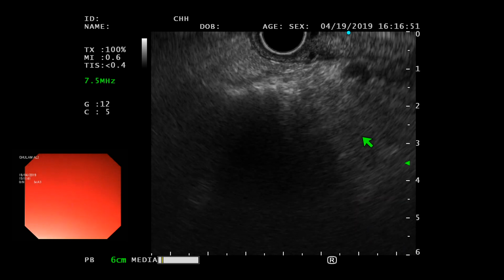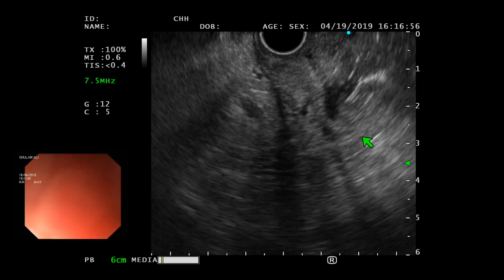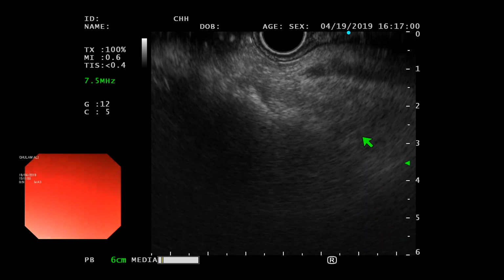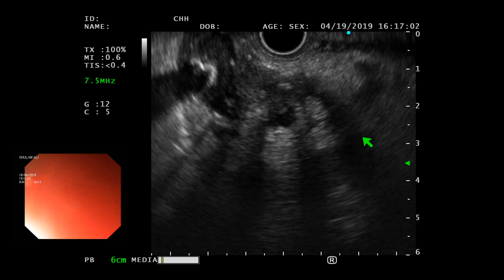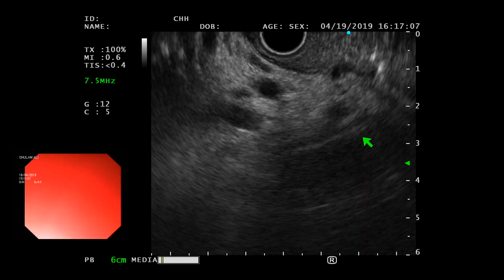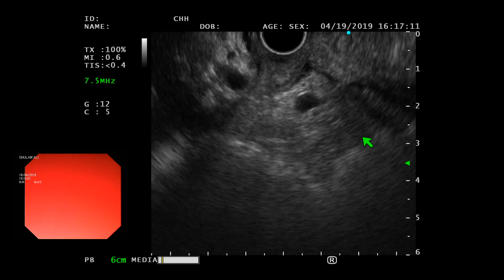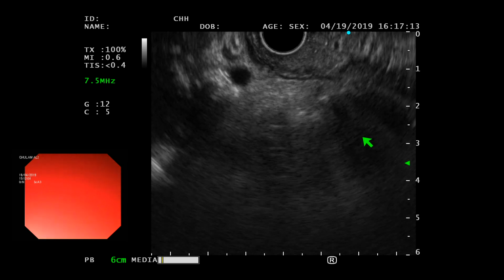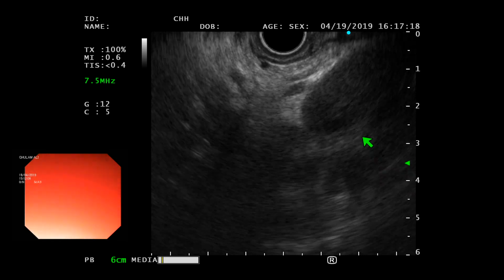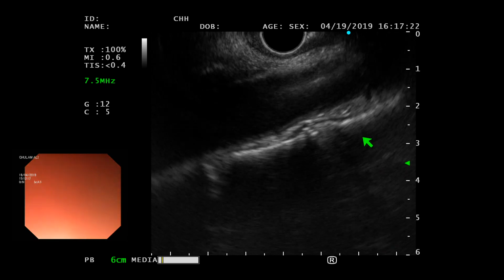Okay, this is the kidney. I have already turned behind while getting the spleen, and I don't see any spleen yet. No, I don't think it's wrong, let me see. No, no, your transducer may not be in the right place. Let me see. Okay.